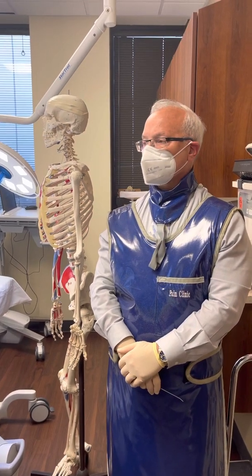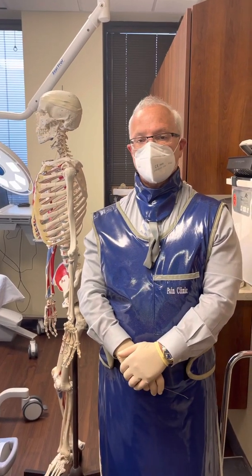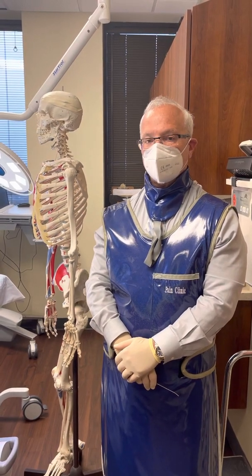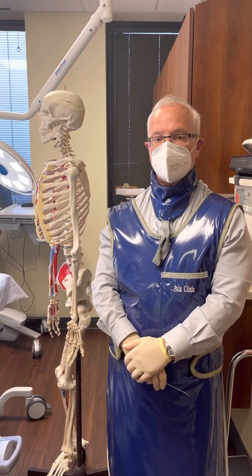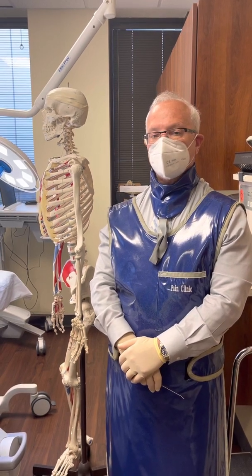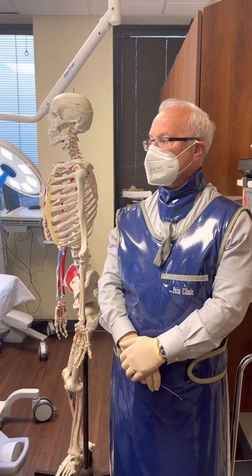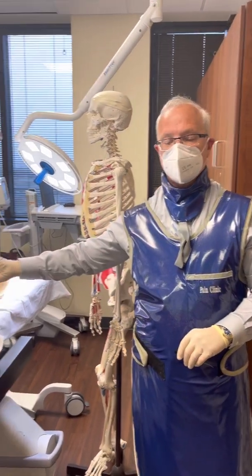For demonstration purposes, since I'm not using a live model today, I will be demonstrating the C4 dorsal root ganglion nerve procedure, exiting the intervertebral foramina at the C3-C4 level, and to do so I'm using an anatomical model.